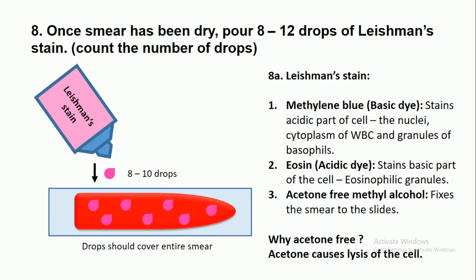Once the smear has dried, add 8 to 12 drops of Leisman stain, counting the number of drops as you add them. The Leisman stain contains Methylene blue, Eosin, and Acetone-free Methyl alcohol.